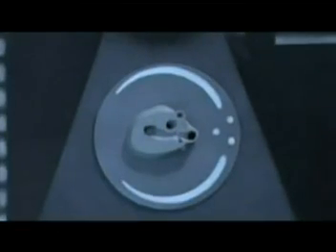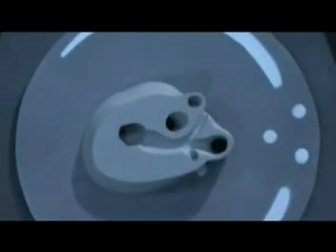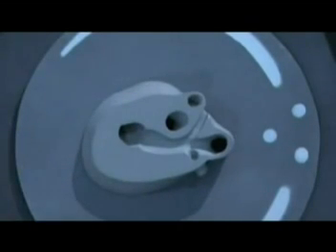Looking at the image here with the model, the baby's spine is on the right of the screen, the left side of the baby is down and the right side of the baby is up, so the baby's head's out towards us with the feet into the screen. And in this view you'll get really good views of the pulmonary outflow.